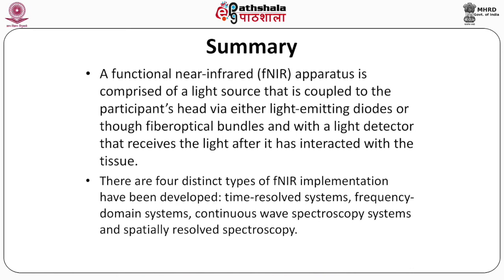There are 4 distinct types of FNIRS implementation that have been developed: time resolved system, frequency domain system, continuous wave spectroscopy system and spatially resolved spectroscopy system.